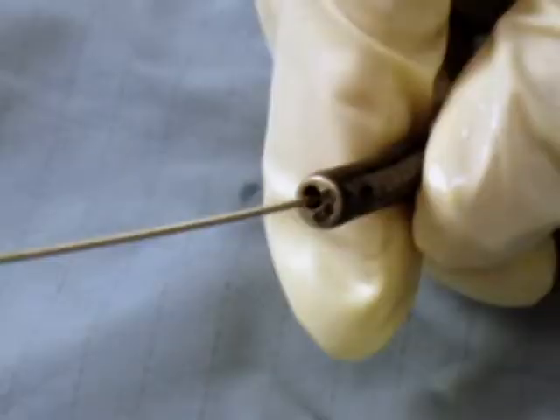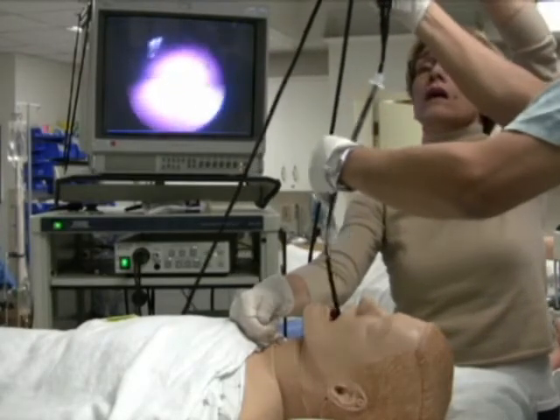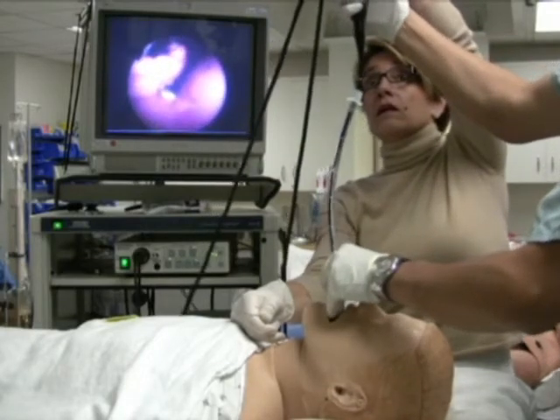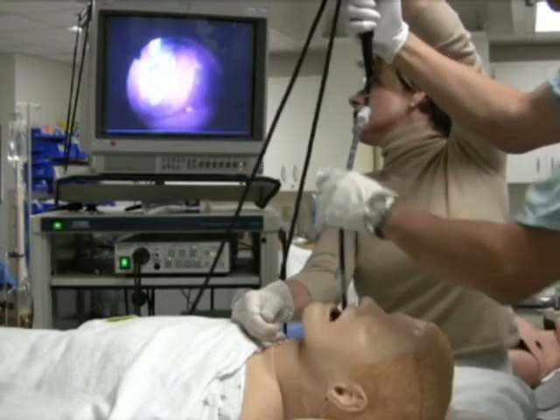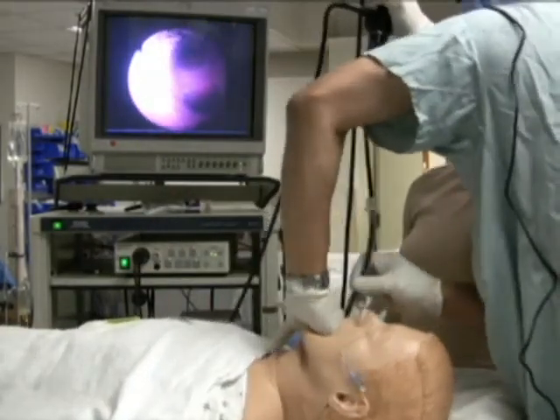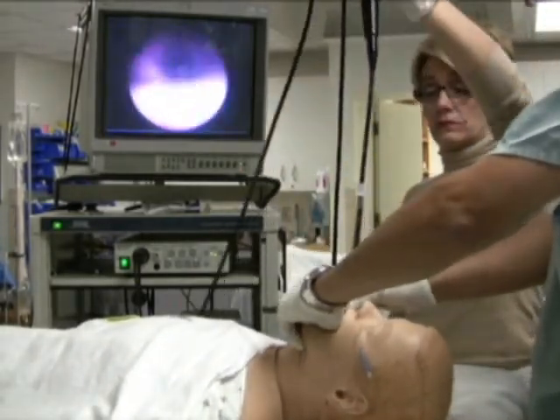Flexible bronchoscope assisted technique: after retrieving the guide wire from the oral cavity, the wire is threaded through the suction channel of a flexible fiber optic bronchoscope. With the guide wire held taut, the flexible bronchoscope loaded with the tracheal tube is then advanced over the guide wire into the oropharynx. Under indirect vision, while gliding along the guide wire, the bronchoscope is advanced into the glottis. The guide wire is then removed before advancing the bronchoscope further into the trachea. With the tip of the bronchoscope above the carina, the ensleeved tracheal tube is then advanced into the trachea.